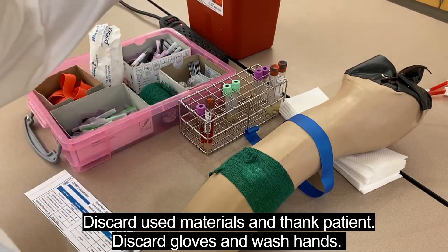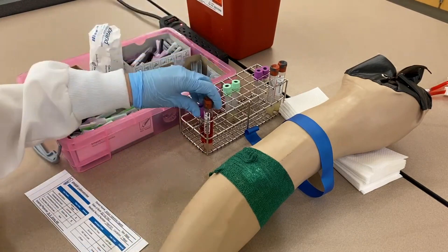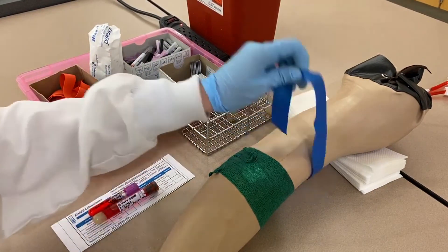Clean up your site, then put the tubes in a bag with the requisition slip and send it off to the lab. And that's how you do a blood draw.